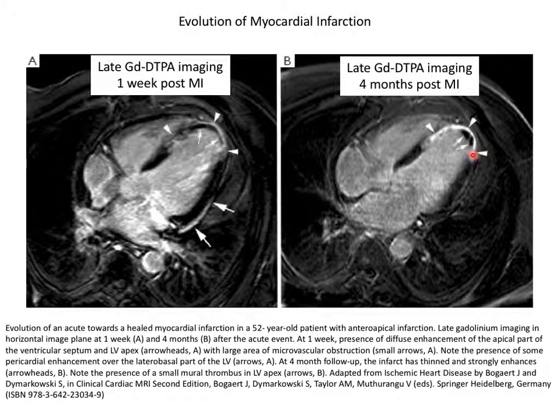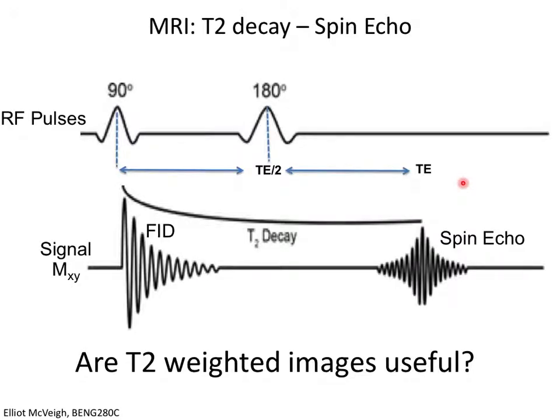You know, it's like, oh, I got pain, gosh, and then it goes away, and then they're left with an infarct there. So it's pretty interesting, and you can tell how old it is sort of by the brightness and the look of it. So let's go back.